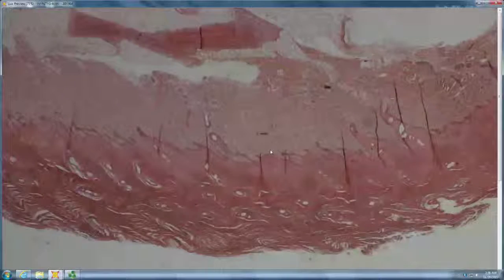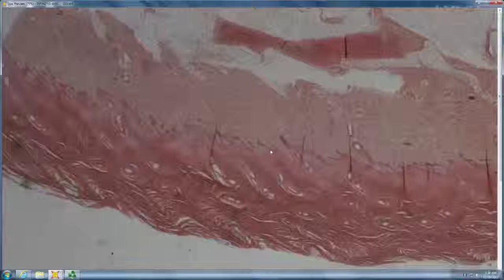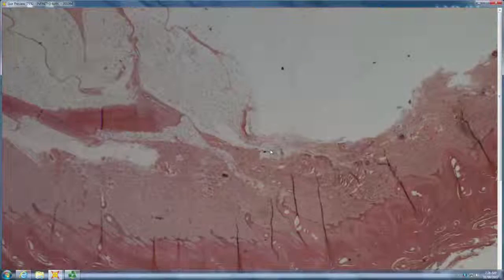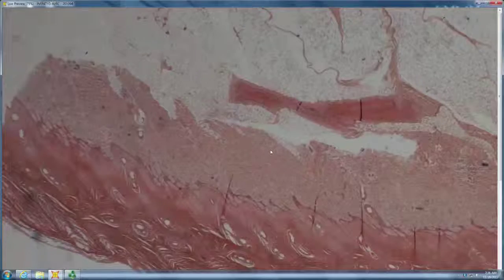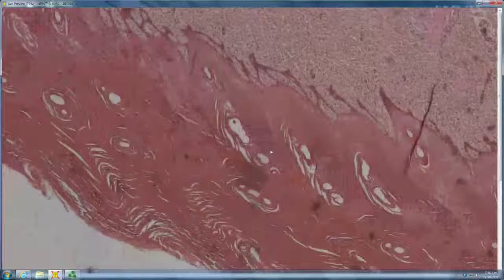So, Rachel, what do you see? See a lot of stratum corneum. A lot of stratum corneum, exactly. Given that the epidermis itself is this tiny little layer there, so massive corneum. What might that translate to? Like maybe a lot of scale, like ichthyosis vulgaris.